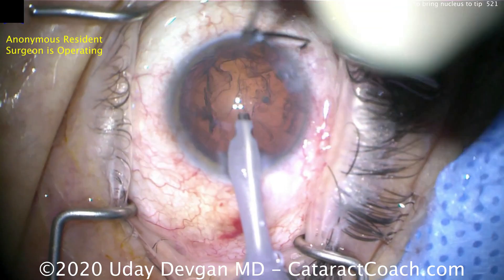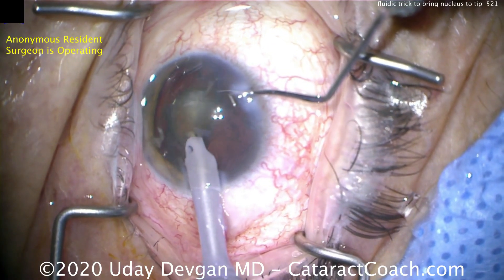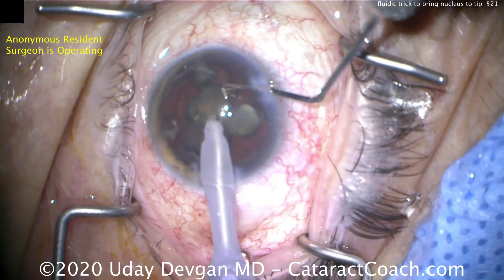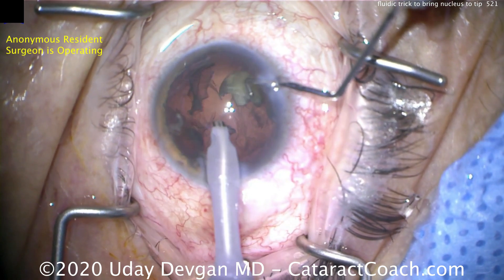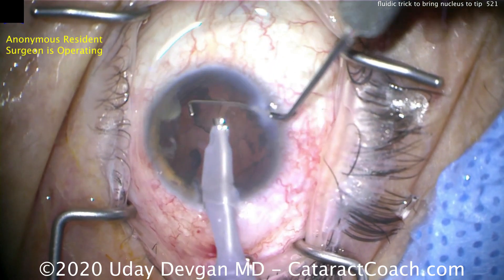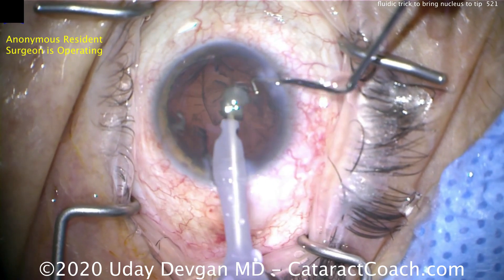Because there's vacuum at the tip — which is negative pressure — it'll draw the pieces right to the tip. This is a very important technique; you don't want to reach into the bag and go hunting for pieces. In the same case, after chopping the cataract into smaller fragments and emulsifying, the pieces bounce around a little, and now to get that one big chunk, just twist the phaco probe and it comes right to the tip.